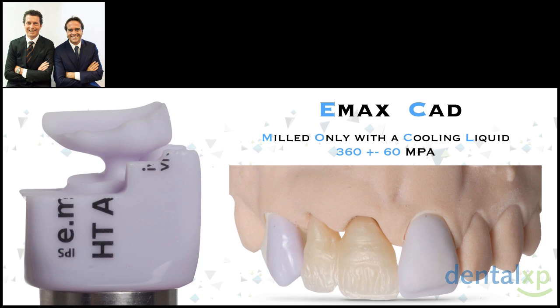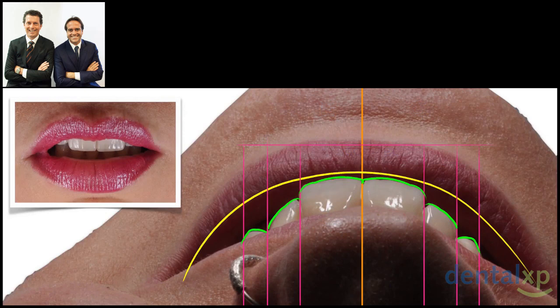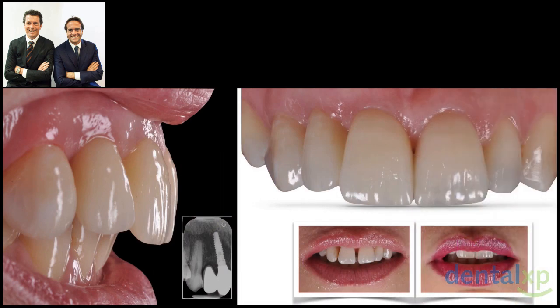Utilizing two different materials in this case, we will have two lithium disilicate veneers and a zirconia framework on top of which ceramic is going to be layered for the final aesthetics in the implant restoration. And look at these final images. You see that the blueprint of the digital smile design was maintained and reproduced in the final restoration. Look at the smile of the patient, the diastema is closed, and this is the final restoration in place.